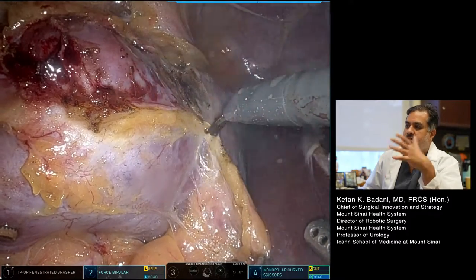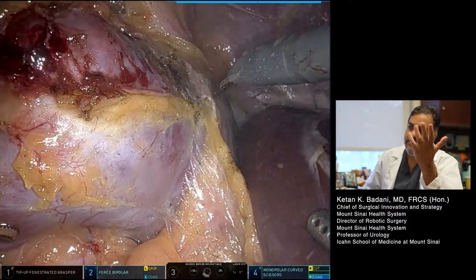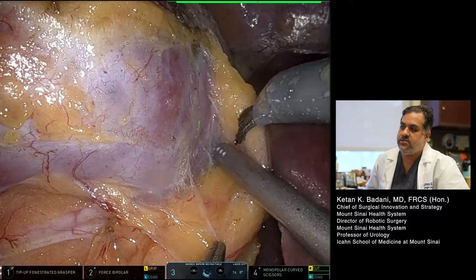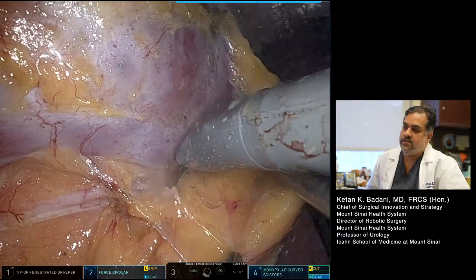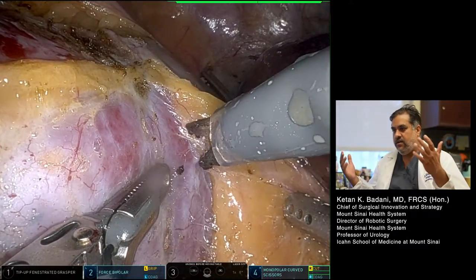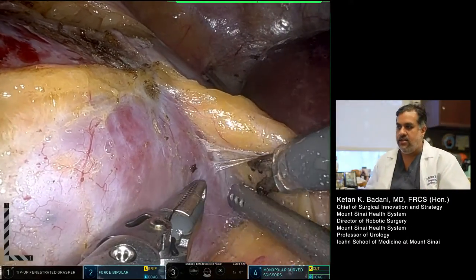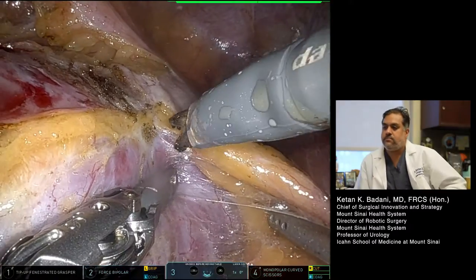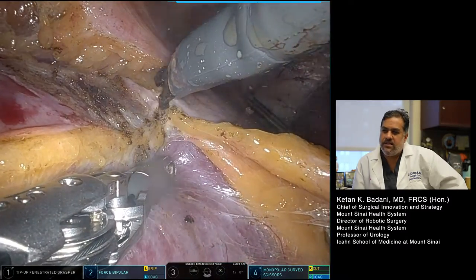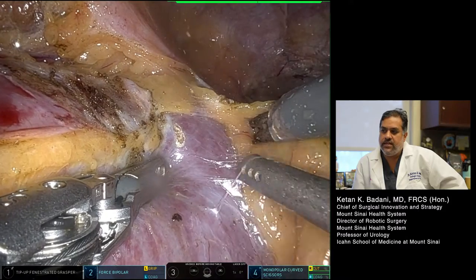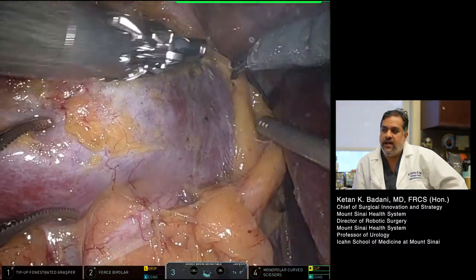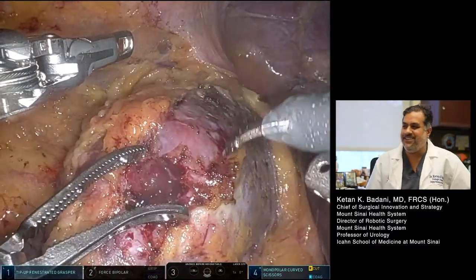We're going all the way down — it doesn't add much time. Even if it's adherent fat or what we call toxic fat, it may add a little time for the extra dissection, but it's well worth it. If you need more exposure and you have adherent fat, that's even more difficult when you're halfway through an excision during clamp time. The amount of time it takes to do a wider exposure of the kidney isn't that much, and the value is far higher than the time allotted for this.